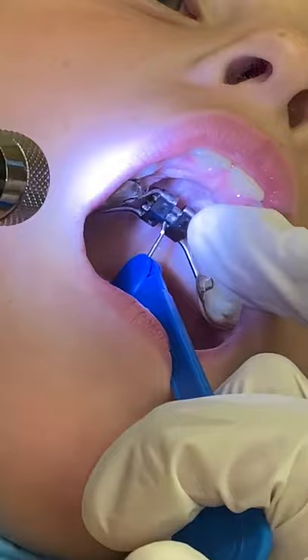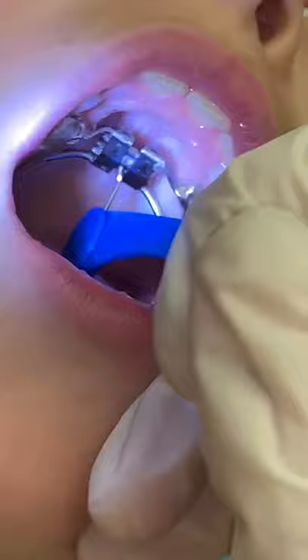We saw a new hole appear on top. You want to make sure you're seeing a full circle before you take your key out. Once you do, make sure you're sitting this all the way down. We're going to take our finger and glide it down this RPE key and eventually it'll come out and down.